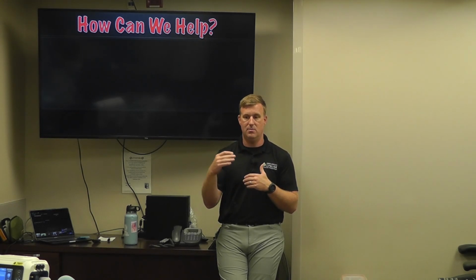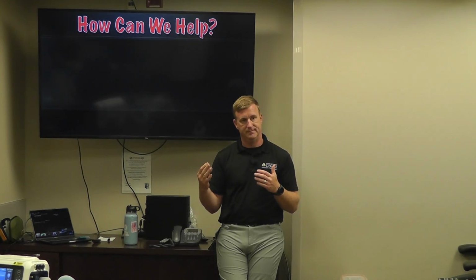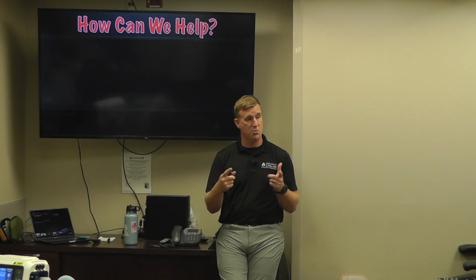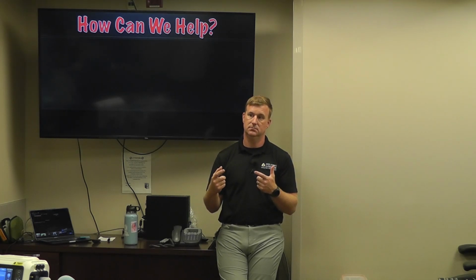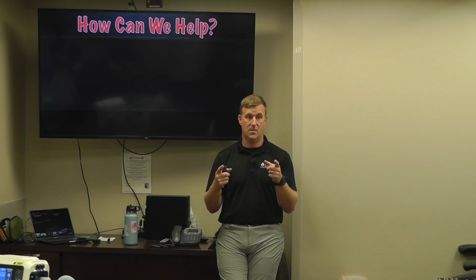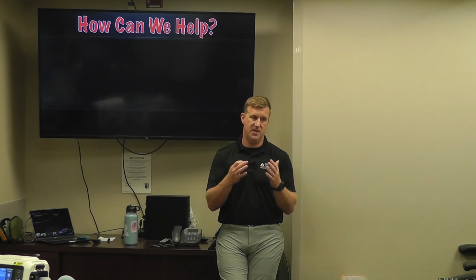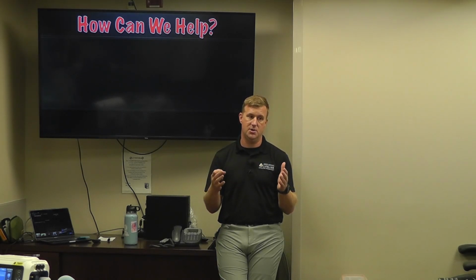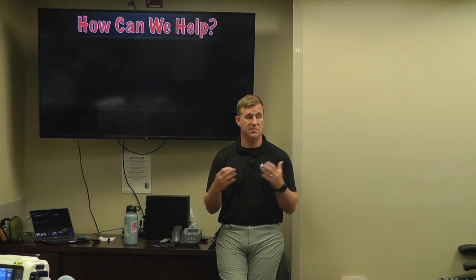Okay, and then there's BiPAP. What's the difference between CPAP and BiPAP? Two pressures. So when does that second pressure kick in? When they exhale? Should be during inhalation. So it should be triggered by inhalation. It should always be triggered on inhalation. It may get false triggered depending on the sensitivity on the ventilator, those types of things, but it's always on inhalation.